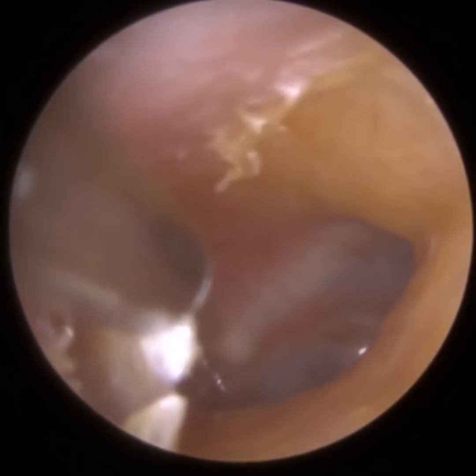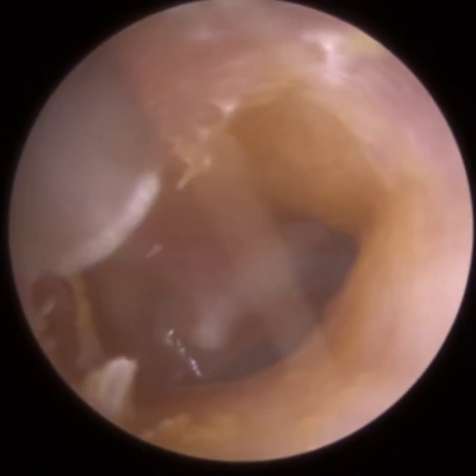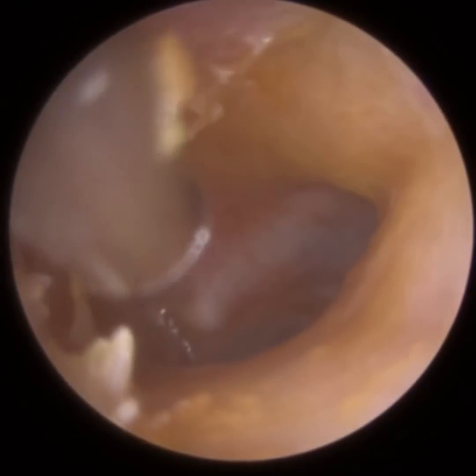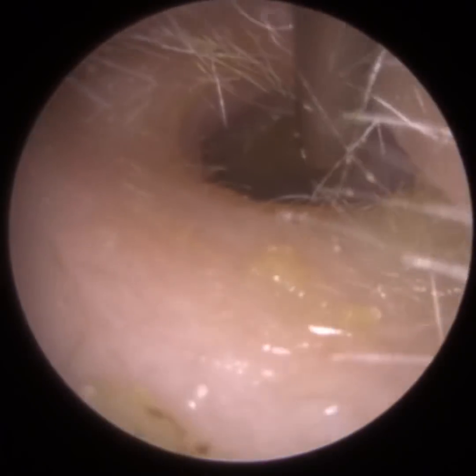And the reason why I'm trying to get this skin off, in most cases we'll leave it, it's just this patient's got a chronic history of ear infections, otitis externa, an infection of the ear canal. And you'll see on the right side, as I said, there is some evidence of some fungal spores there. The patient's eardrum on this side is also retracted. You'll get a close-up a bit in a moment.